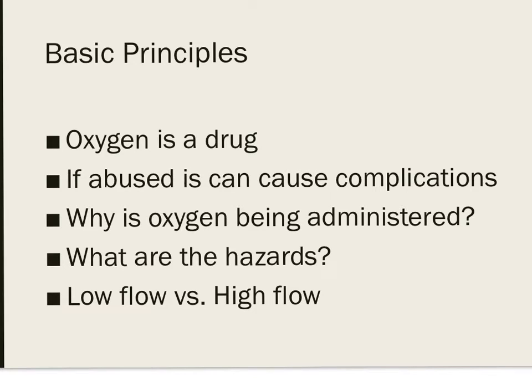Low flow are what we're used to, like a simple face mask, a non-rebreather, nasal prongs, where the oxygen delivery is inconsistent. It's dependent upon various factors, versus high flow, which is consistent delivery of oxygen therapy. One example I'm going to give you is the Venturi system, which we're going to talk about.